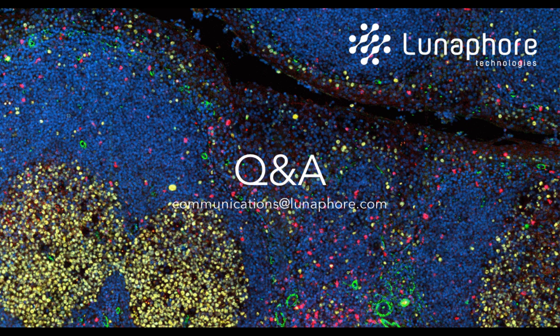Great. We have another question here regarding the type of sample. This question is asking, what is the thickness of the sections that we can use? So we typically use FFPE samples mounted on standard histological glass slides of about 2 to 5 microns thick. Excellent.